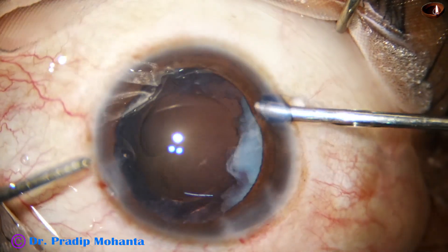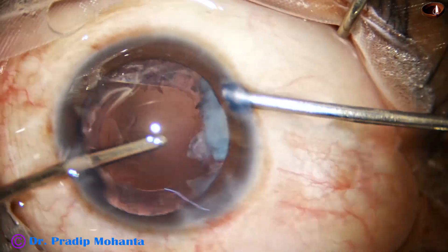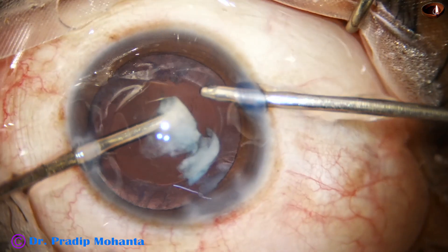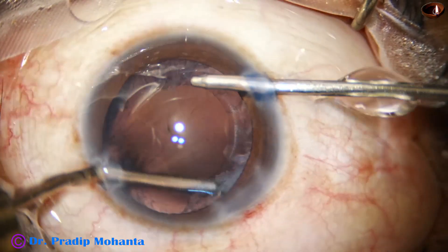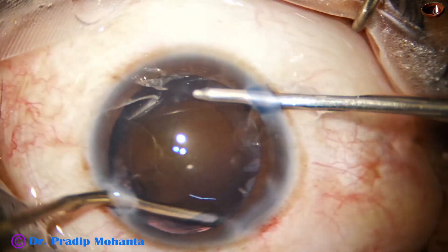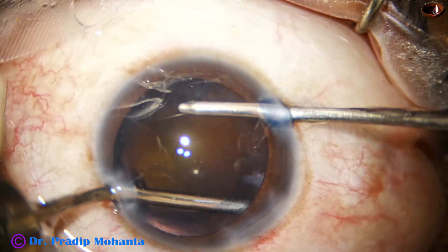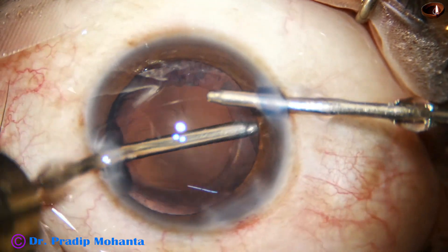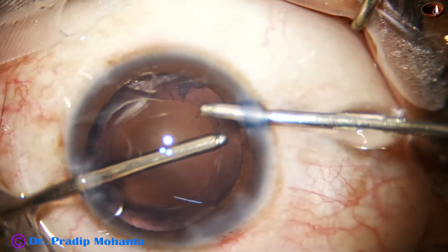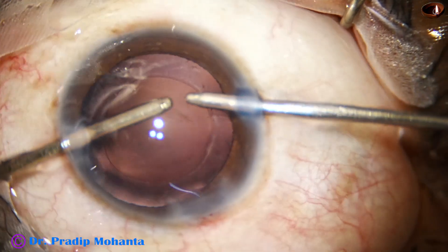We can see some cortex on the right side, so irrigation from the right side and aspiration from the left, and I try to remove this cortex — it comes very easily, it is so soft. Now the rest of the cortex is being removed by bimanual irrigation-aspiration.